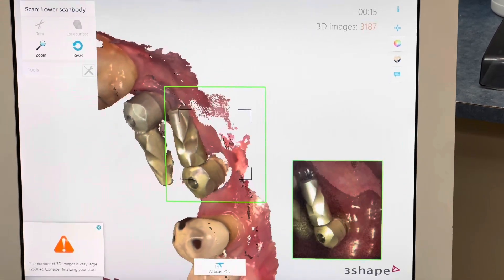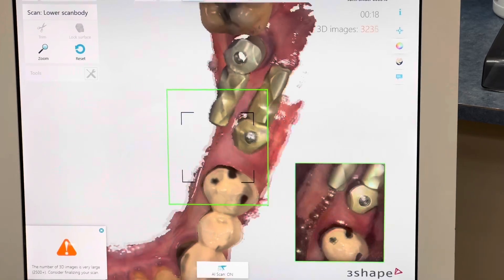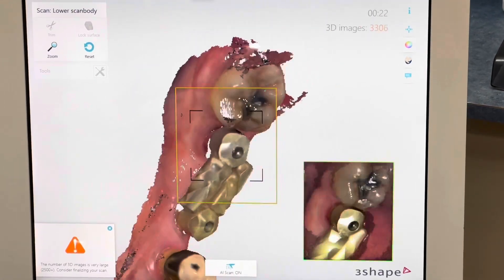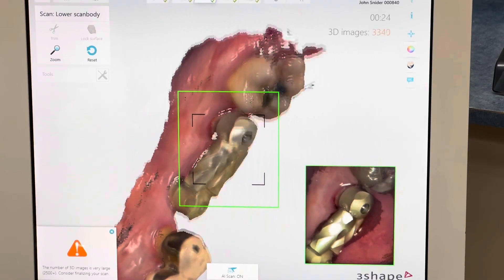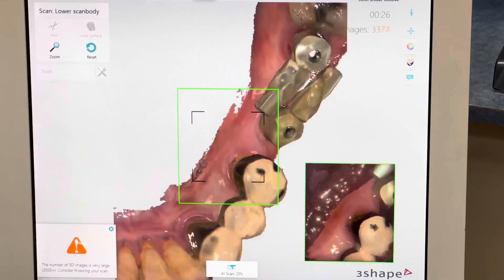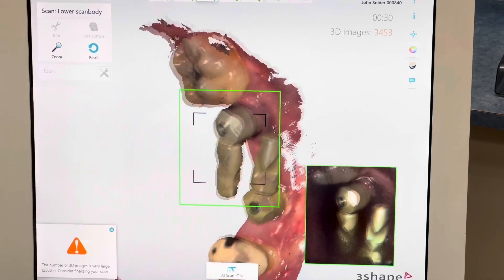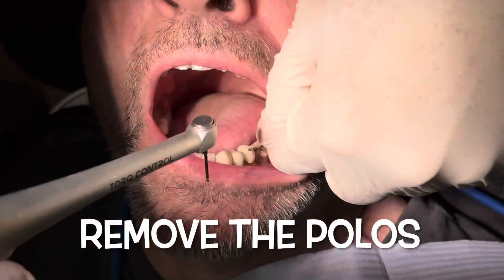We don't want to over-scan because layering actually causes inaccuracies. It's like painting a room — each layer adds thickness. So we have to do a very minimal scan pass and then send that off to be manufactured.